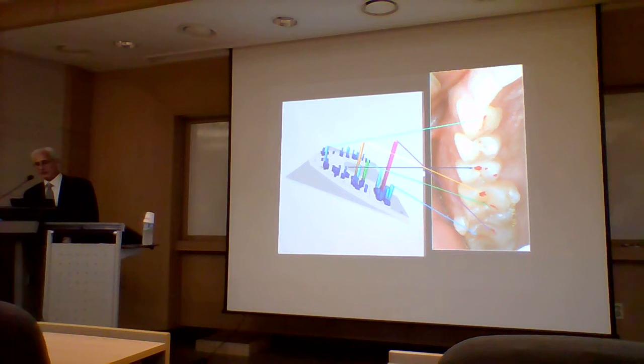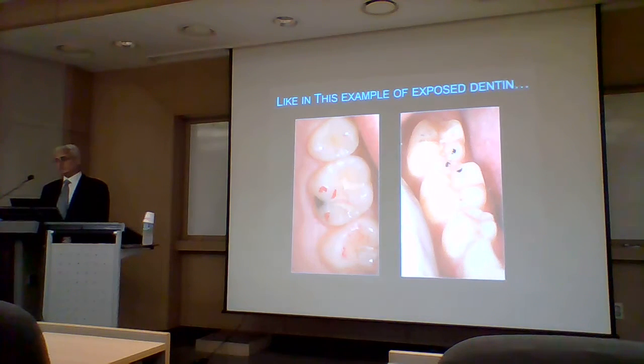So the question becomes, how would you know what these mean without this information? 디스캔 없이 그런 걸 갖다 확인할 수가 없는 거죠. And the answer is we don't know. And the problem is we face this every day when we mark teeth and try to determine force. And we can be misled. 날마다 하고 있는데 그런 것들 갖다가 이제 우리 개심해가지고 하고 있다라고 하는 돌아오게 되는 것 같고. Like in this case.